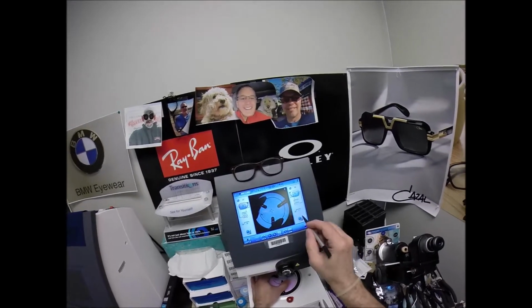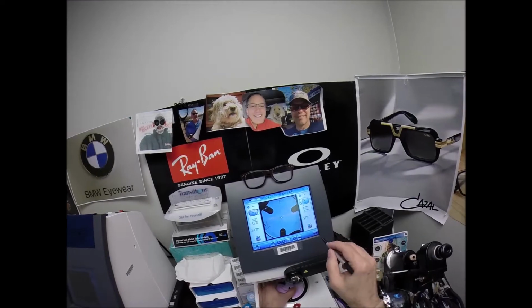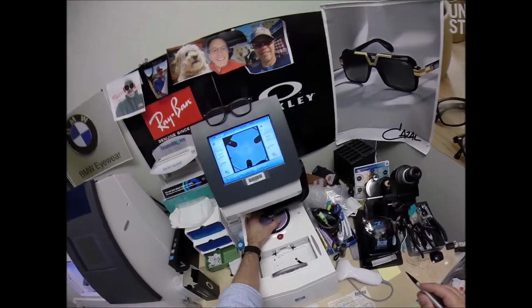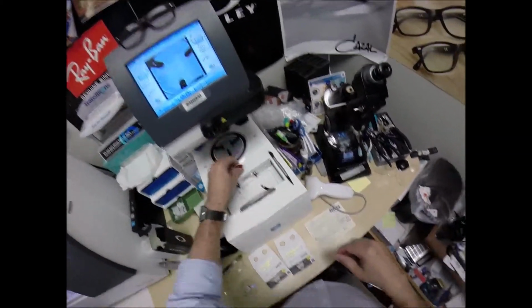So, I always like to make sure the lens is large enough to fit, and it is. Get everything lined up, hit that button. The arm's going to come down, place the block onto the right lens. We're going to do the same thing now for the left lens.